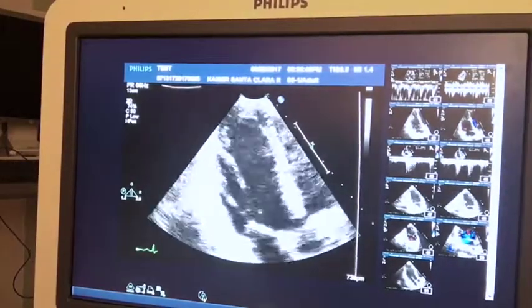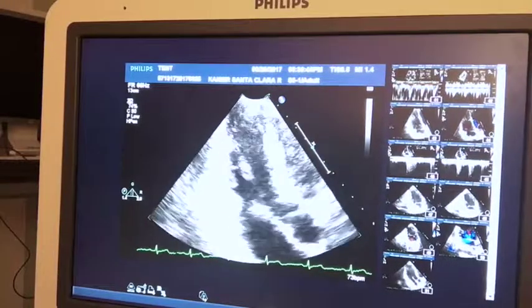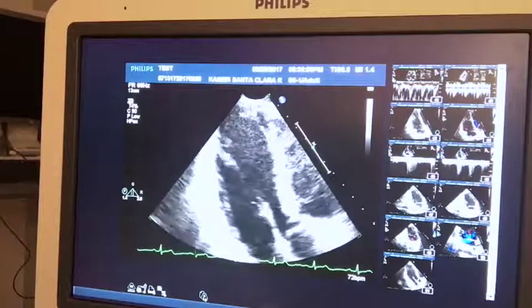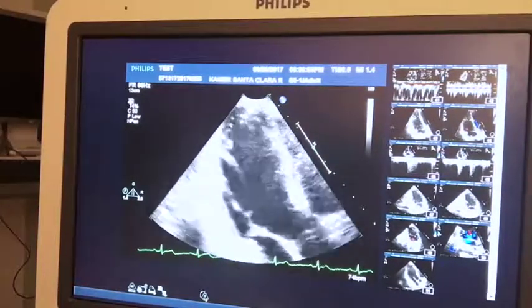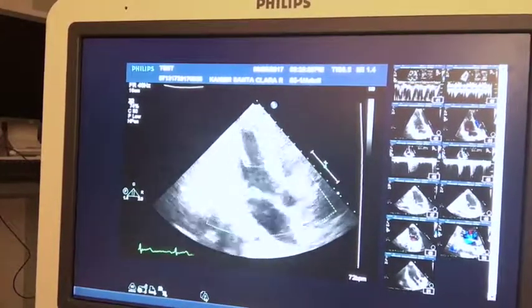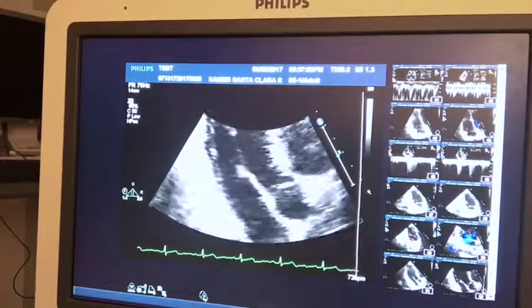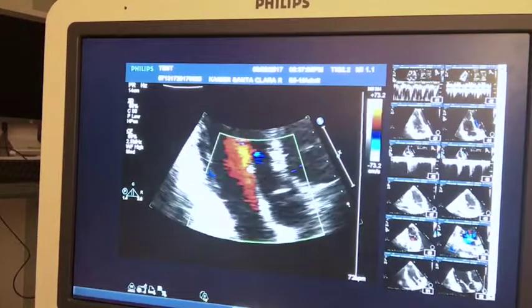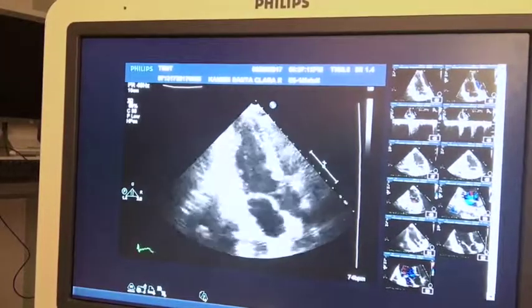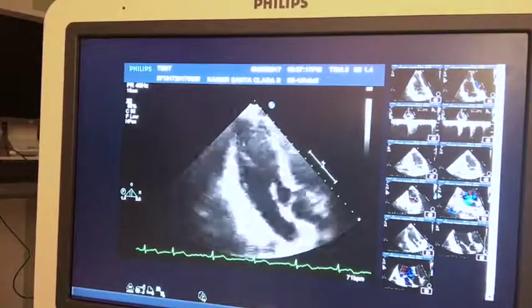Now I'm going over to an apical long view, or what they call a 3-chamber view, and sometimes I'll zoom again, depending on what's curious about the image. If it's curious because of wall motion or coronary artery disease, the person had an MI, or an abnormal EKG, then I want to make sure I document well on all views what's happening with the left ventricle, because that's what most physicians, cardiologists or not, are interested in. They're mostly interested in the pumping capacity, the ejection fraction. So you make sure that you have good endocardium, a good view, a good picture, right? And the secondary concern, especially in young patients, is regurgitations or stenosis, because it's very rare that that's going to happen.